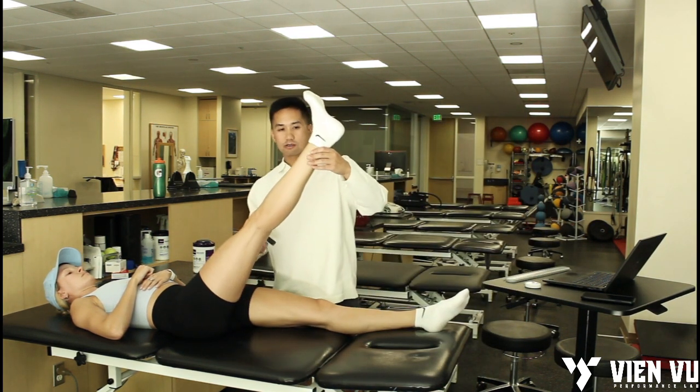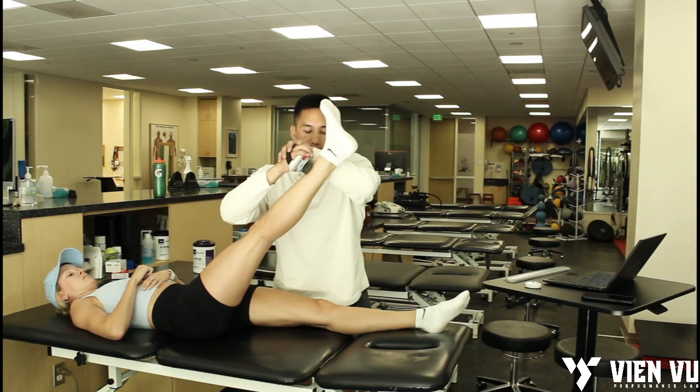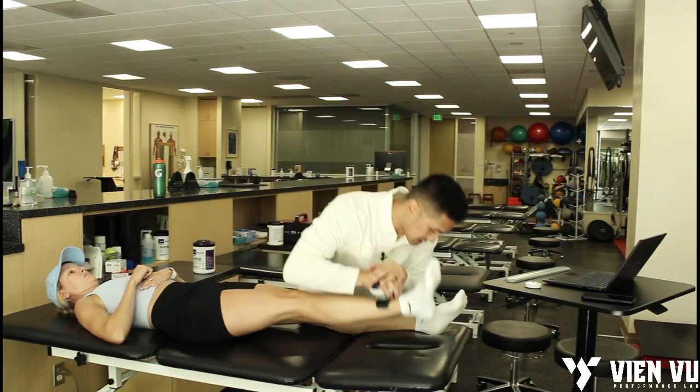From here we're going to look at right side flexion — the involved side flexion. Resist it, resist it, resist it.